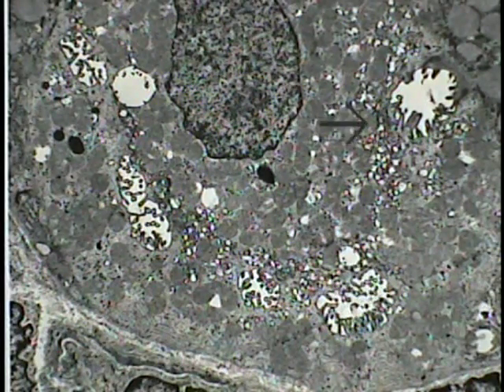Note also the well-developed tubulovesicular component. These small vesicles of membranes that surround the canaliculi. So they are in abundance. Note also the scattered mitochondria, which make up a considerable volume of this particular cell type, and why it acquires the reddish hue when stained with the hematoxylin eosin stain. It is these mitochondria that are staining. So this is a transmission electron micrograph demonstrating a resting or a non-active, non-stimulated parietal cell.